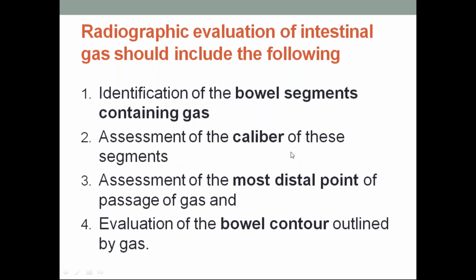What is the 369 principle? The small bowel diameter will be maximum up to 3 centimeters. After that, large bowel will be 6 centimeters. That is the maximum you have to take. If it exceeds 3 centimeters for the small bowel diameter, then we will call it small bowel dilatation. Likewise for large bowel, it is 6 centimeters, and for cecum it would be 9 centimeters.